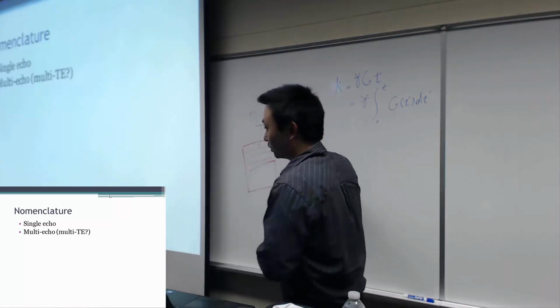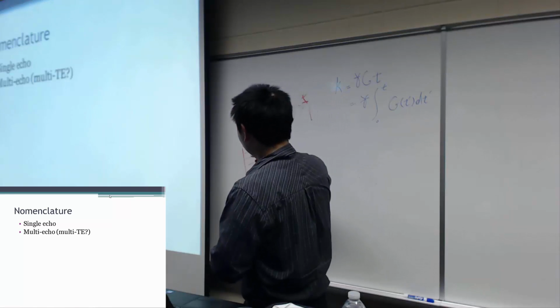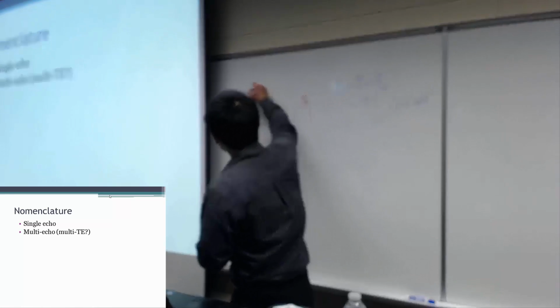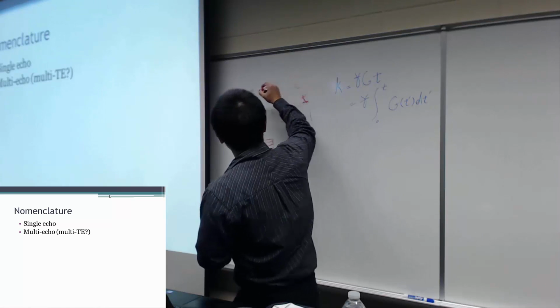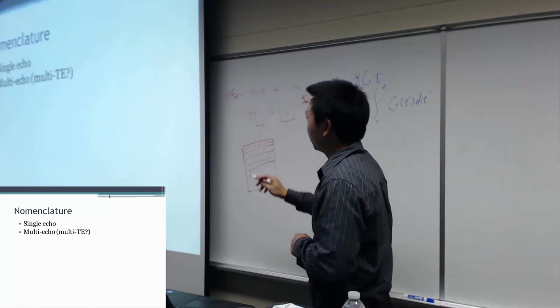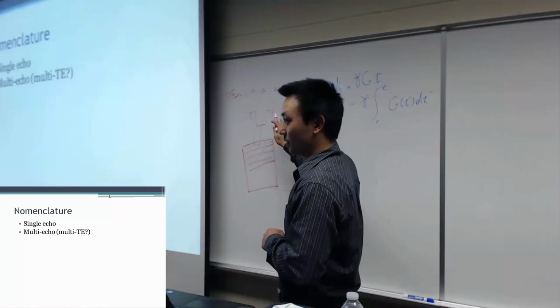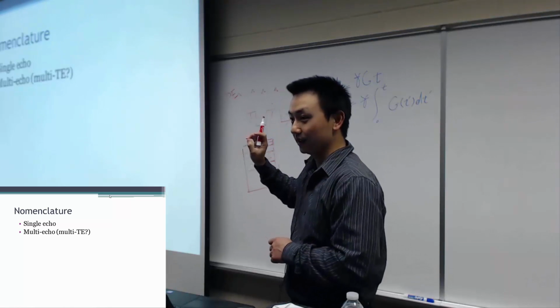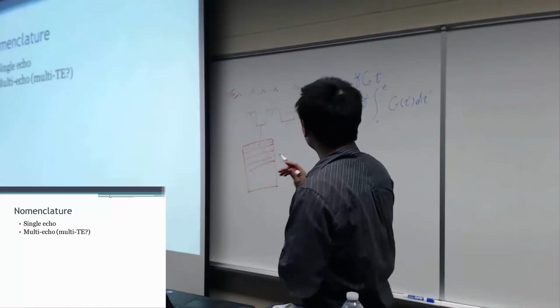So they are all used to fill in the same k-space. To do this, we need to have some blippings of phase encoding along them. But for multiple TE, there is no phase encoding between them because they are supposed to be collecting the same phase encoded line, but for different k-space.